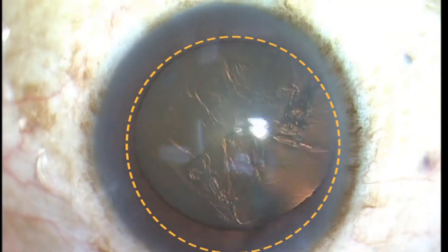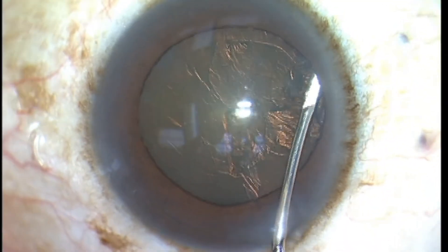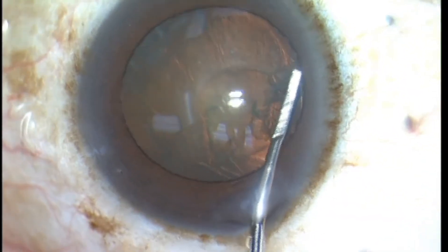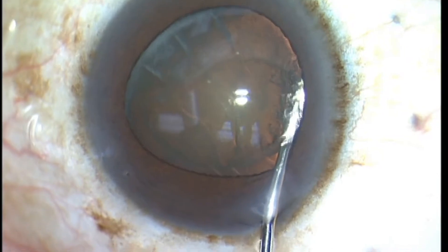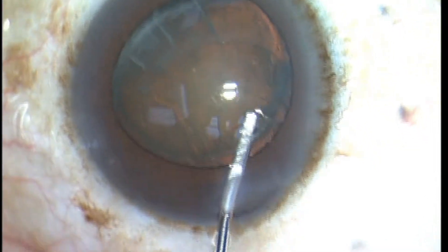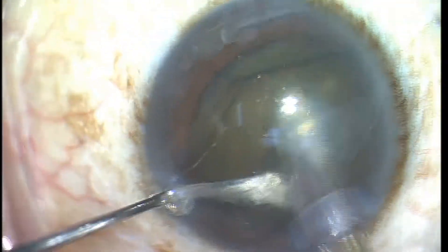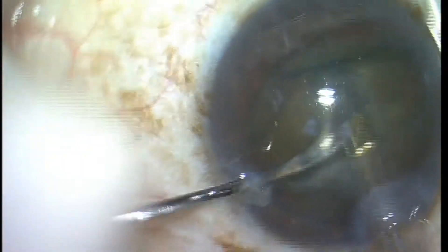Sometimes we are fooled with what the pupil does during the cataract procedure. This is one of my patients. The pupil looked nice and dilated, and this patient did not have a history of any Flomax or similar medication use. So this is my flip and slice technique, a supracapsular cataract disassembly technique.